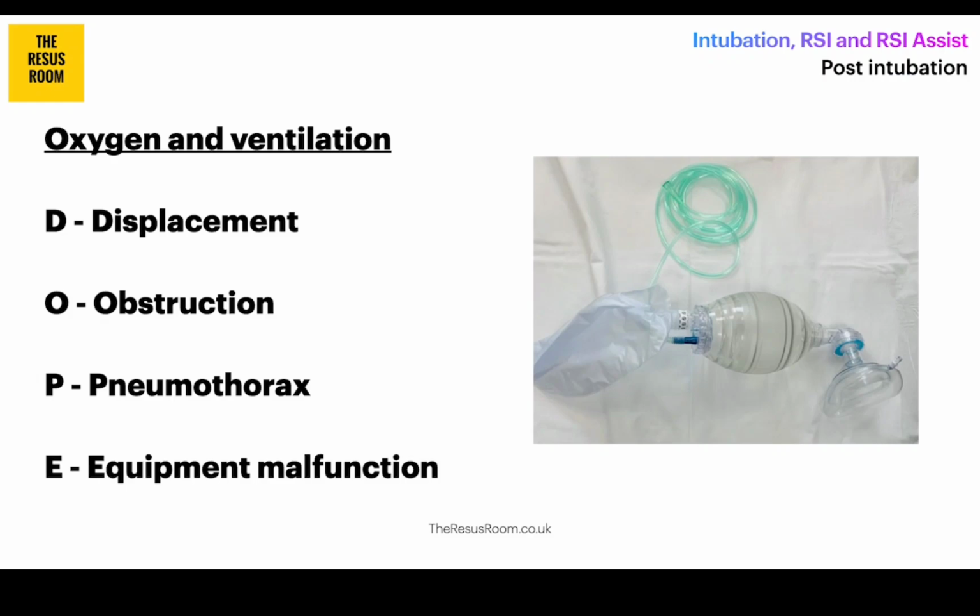P, well, that stands for pneumothorax. So is there any clinical evidence of a pneumothorax? So reducing oxygen saturations, unilateral chest movements, etc., etc. E, well, that stands for equipment malfunctions. So check your tubes, your cords, look for blocked filters, all of those.